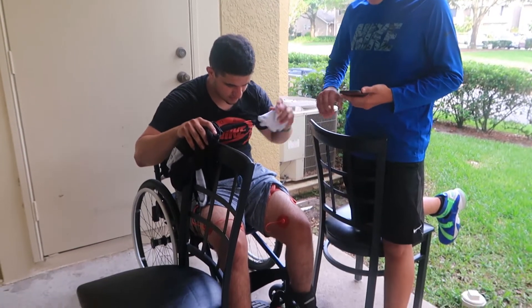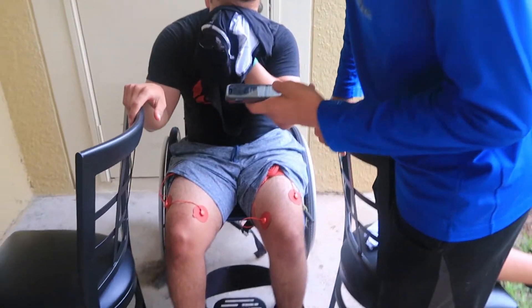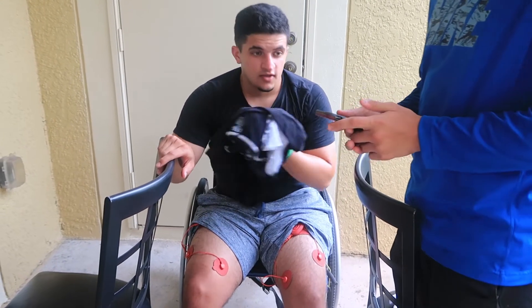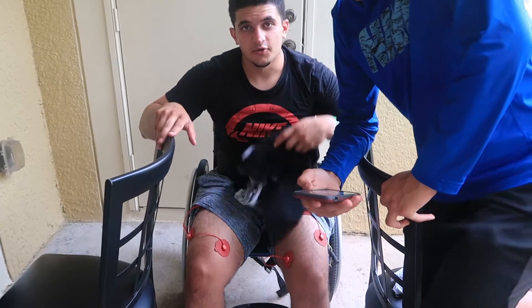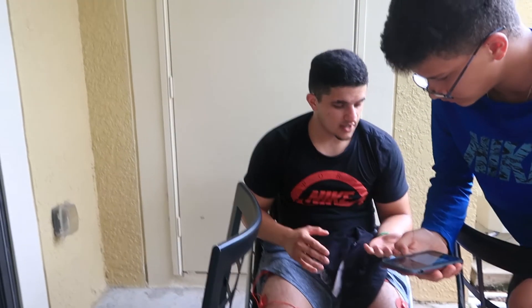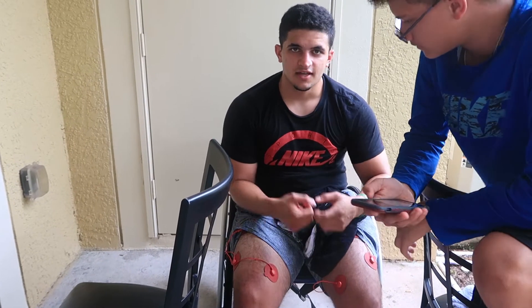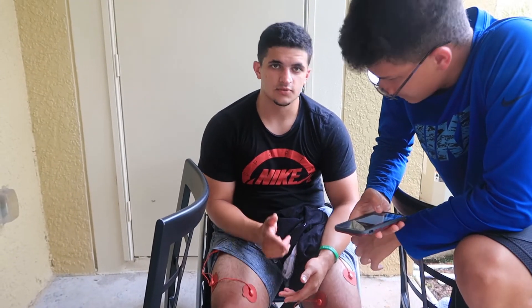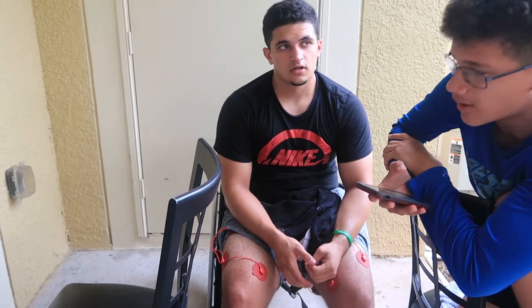There you go. My wrist hurt. You've got zero sessions on these pads — that's been a lot for a while. So I can stay up for longer, but another issue is the wrist — the pressure it puts on my wrist is a lot, especially holding up pretty much all my weight. It's just a lot on the wrist. We're going to figure that out too, and then the hips also. A new video will be coming out once I figure that out. Updates, people.